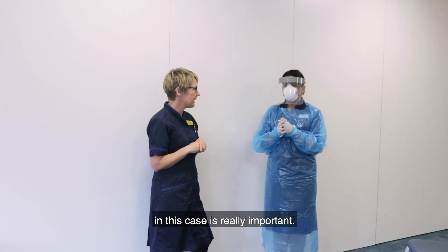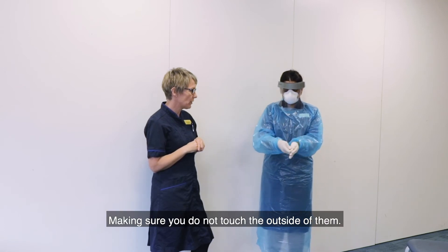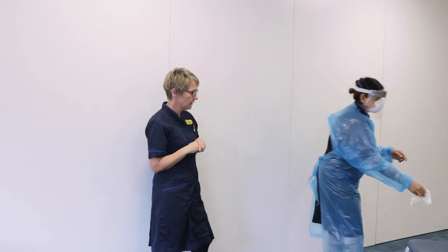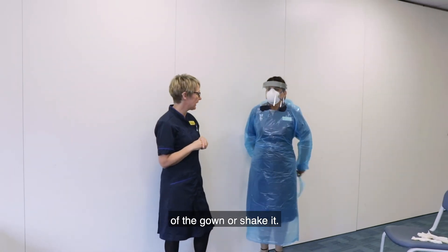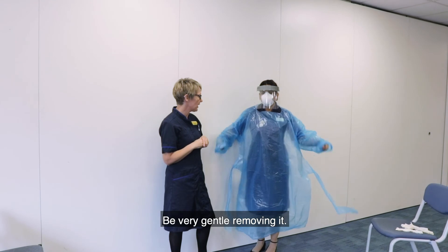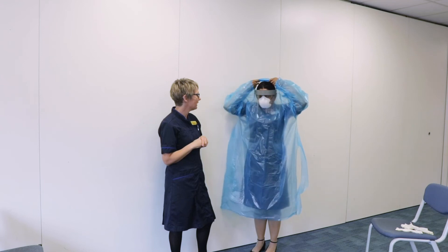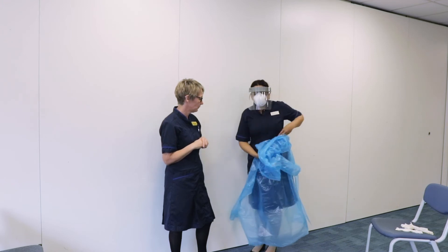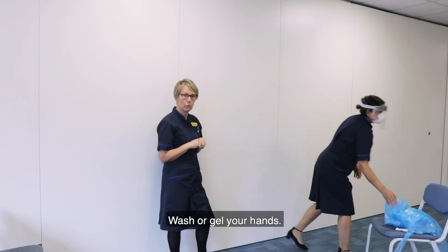Removing your PPE in this case is really important. Firstly, remove your gloves, making sure you do not touch the outside of them. Dispose of them in the clinical waste and wash or gel your hands. Next, remove your gown — this is probably the most risky part. Please make sure you don't touch the outside of the gown or shake it; be very gentle removing it. Roll it up and dispose of it in the clinical waste. Wash or gel your hands.